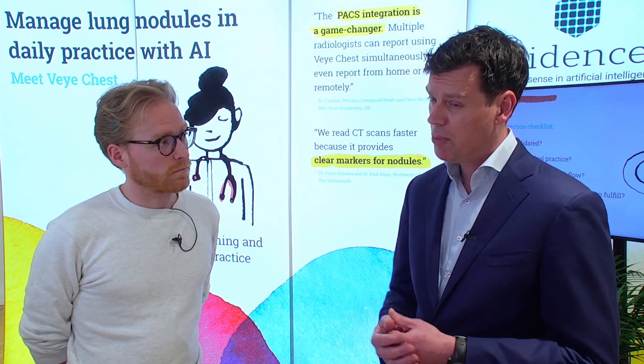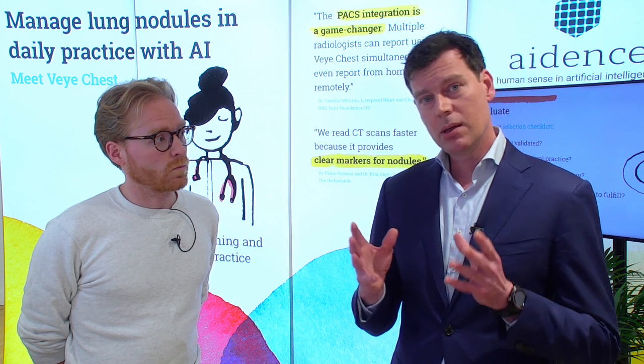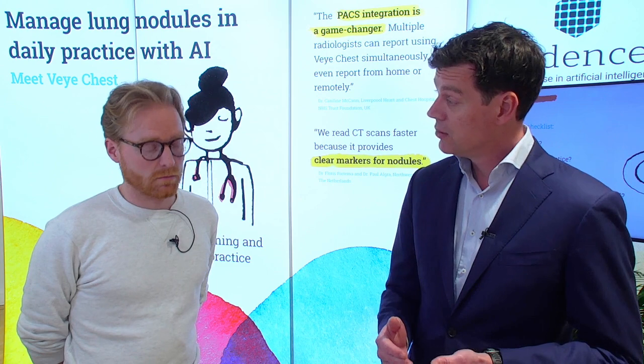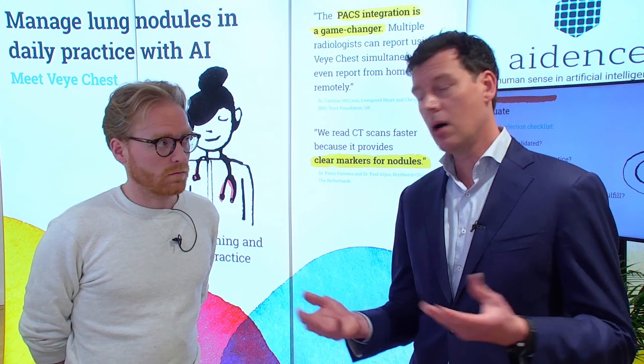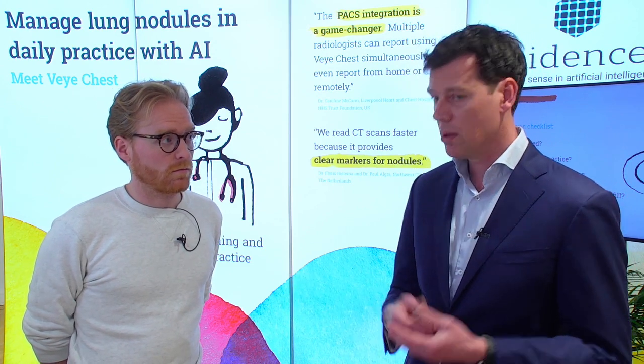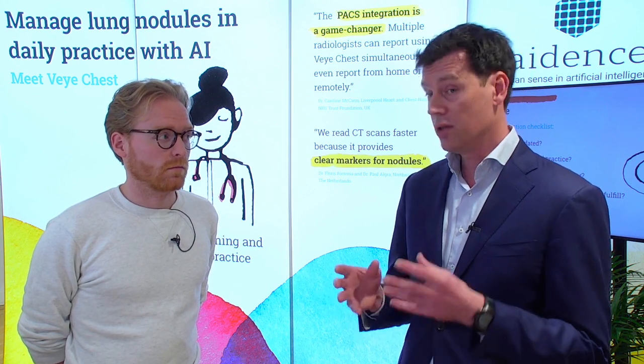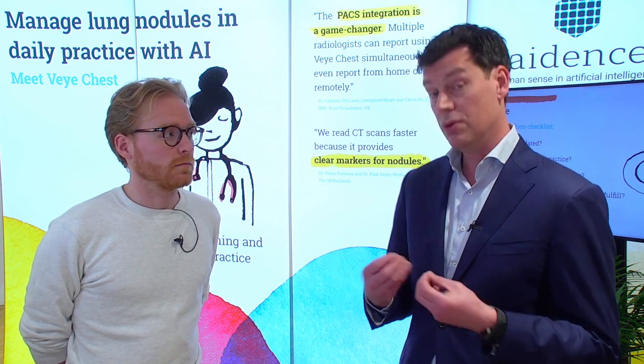And there it's also very important to ask a little more. So what exactly is the claim that has been validated? Having a CE mark or an FDA clearance is important, but what is that claim actually for? What does it cover? And does the claim actually cover the use case that you have?